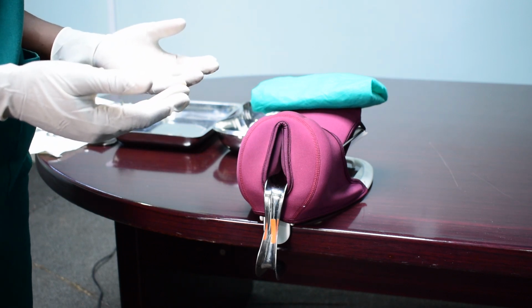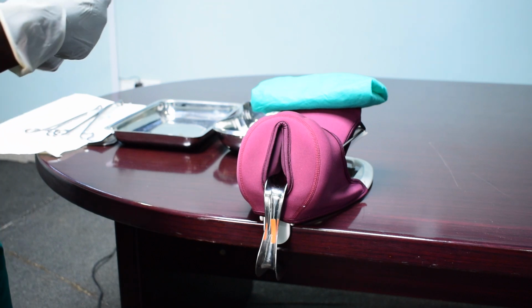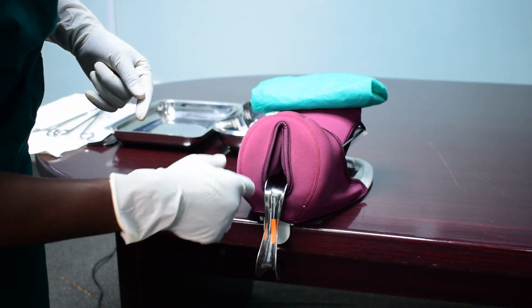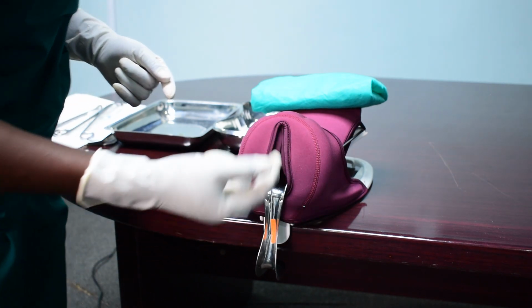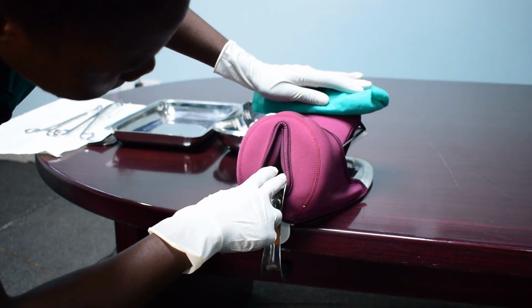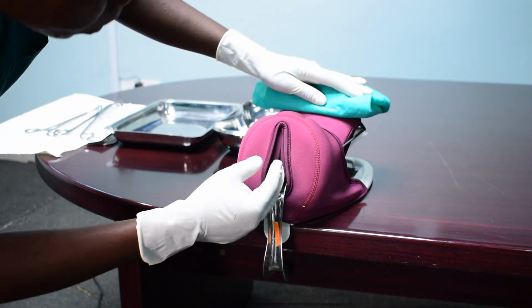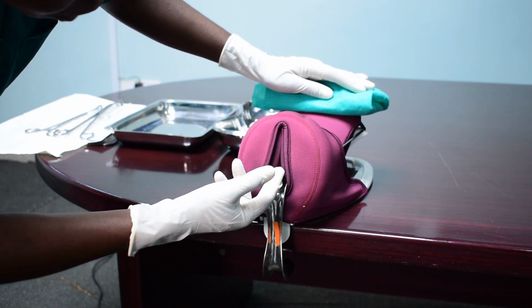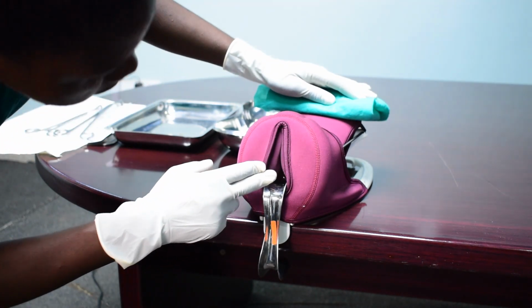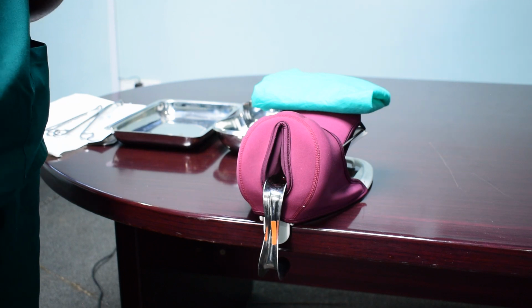After doing that now, we are going to go ahead and examine to see if our IUD has not come out with our forceps. Also, we want to ensure that we actually didn't leave it just somewhere around the vagina, or it has come out and been misplaced. So we will just examine to see if the IUD is here or the strings are very long and protruding outside. So now here our IUD has been placed properly. We cannot see it protruding inside the vaginal canal, and also we only see the strings protruding from out of the cervix. So that indicates that we have correctly placed our IUD.